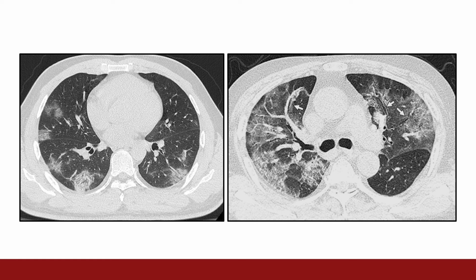However, CT scanning must be balanced with the difficulty, risk, and expense of performing this test. Transporting a patient out of the emergency department or ICU and away from resuscitation areas represents a risk to a critically ill patient. Additionally, the transport of a patient out of an isolation area also presents a risk to the clinical staff as well as the staff in the CT scanner. Therefore, a CT scan is only recommended if it really will change management and is really required clinically.